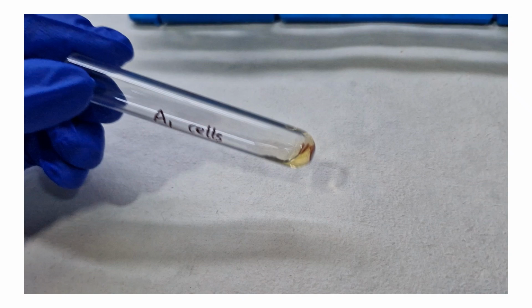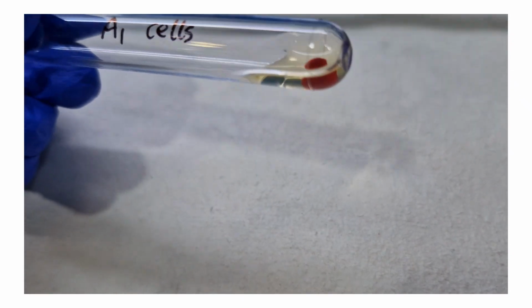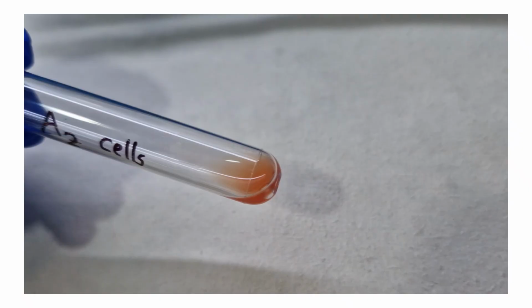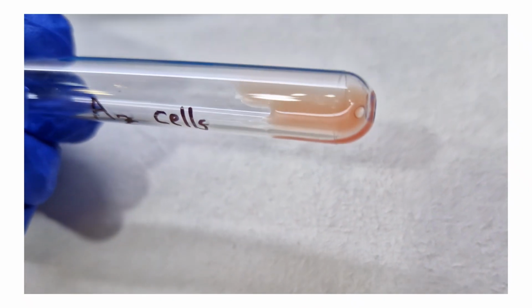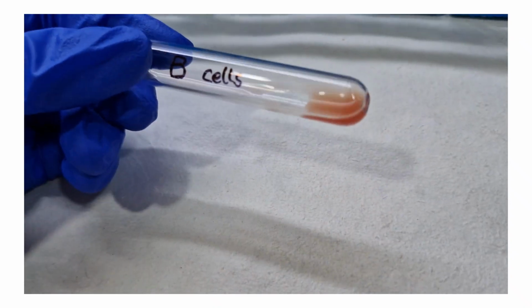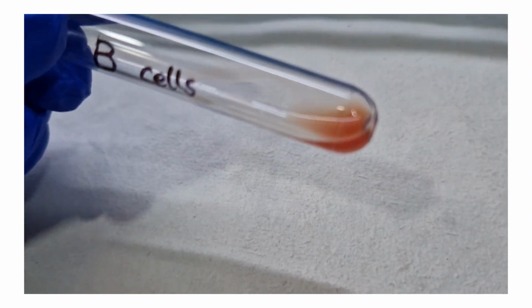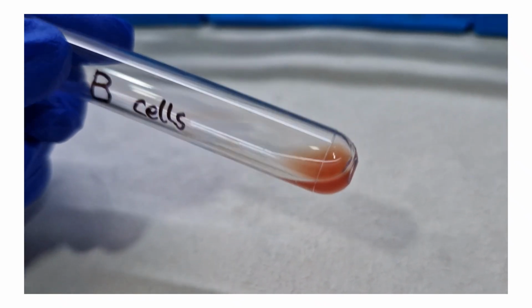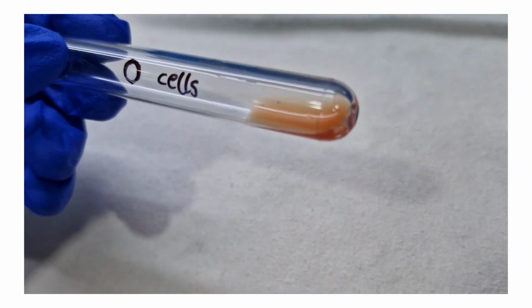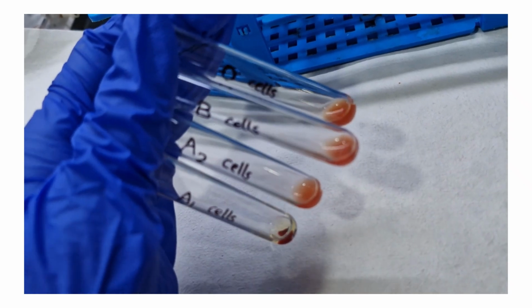These are the results of reverse grouping. In A1 cell, there was a strong 4 plus reaction. In A2 cell, there was no agglutination reaction. In B cells, there was no agglutination reaction. In O cells, there was no agglutination reaction.